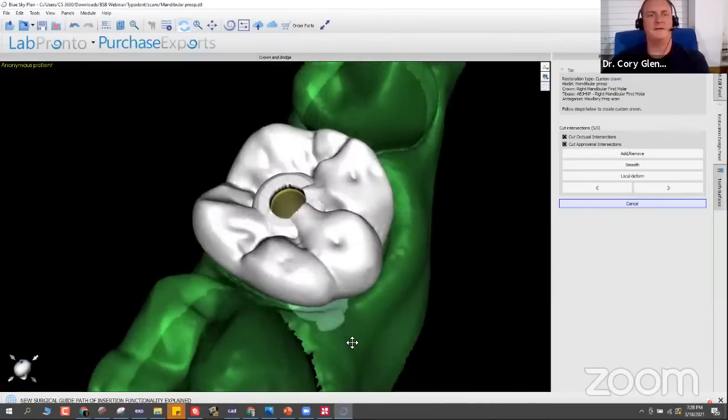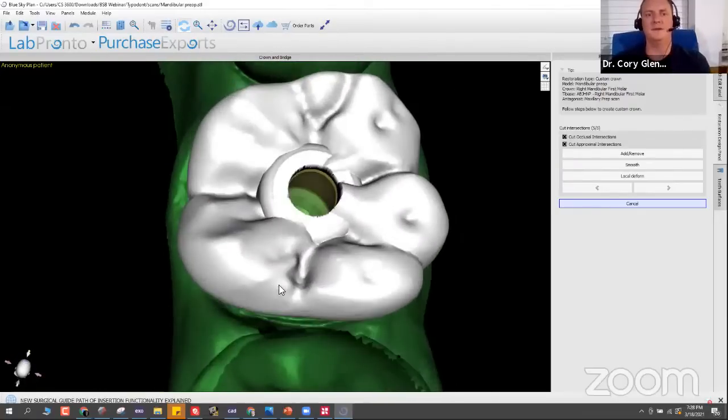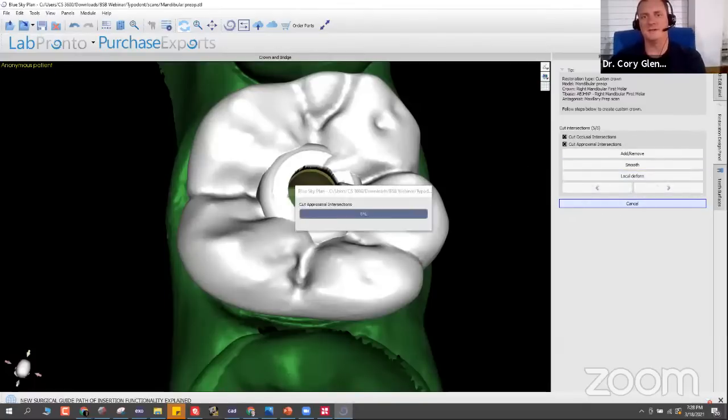And there's our screw retained crown. You see that I didn't really take the time here to adjust this occlusion and pull it up to how it should be just because I was just trying to fly through it. But you do see that the software forced a minimal distance around that tie base so that we can maintain that thickness that's required. So last step would be to cut the intersections. We'll finalize that, and that would be your tie base crown.